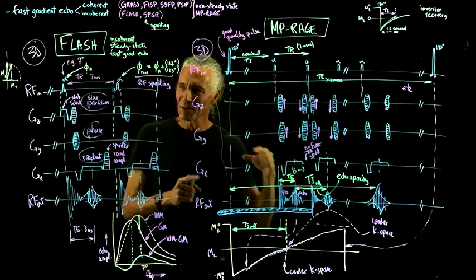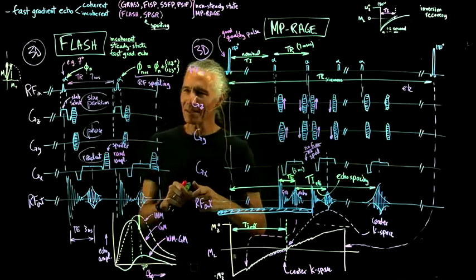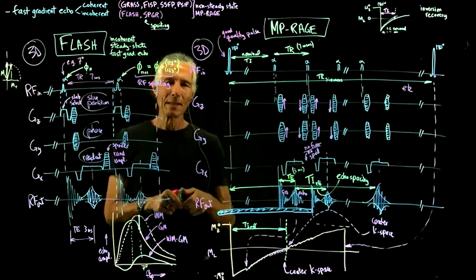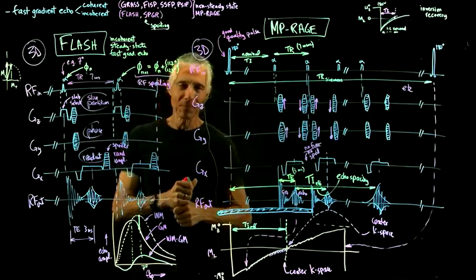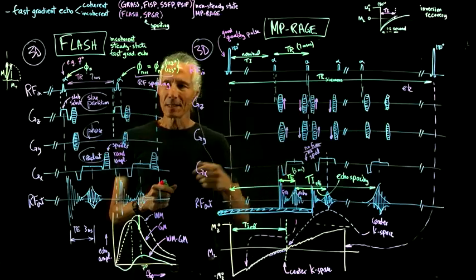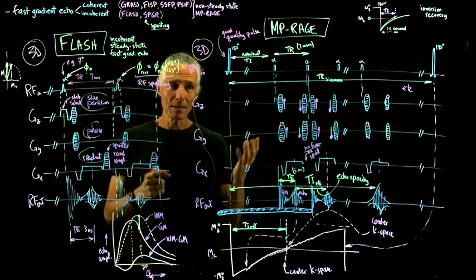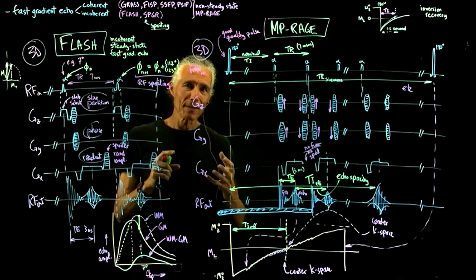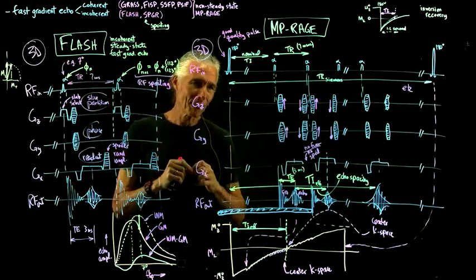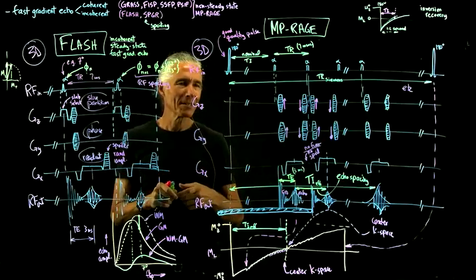And then let's rename everything differently from the other sequences. But why did we do this? Because the gray-white contrast is really good. And so this is basically a standard sequence that you use if you wanted to reconstruct the cortical surface using our cortical surface software. This is the sequence you would use.